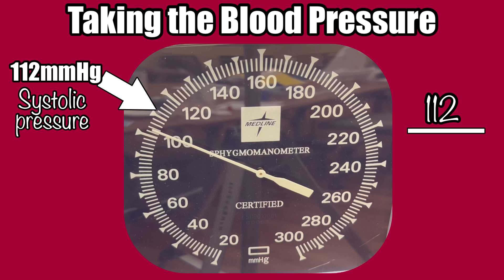Then continue to slowly release the air, dropping about 2 millimeters per beat, and keep listening to that thumping. It will start to fade as the gauge pressure continues to drop, until you eventually stop hearing the thumping at all. The number the needle is pointing to when you hear the last thump is your diastolic pressure, or the bottom number of your measurement.